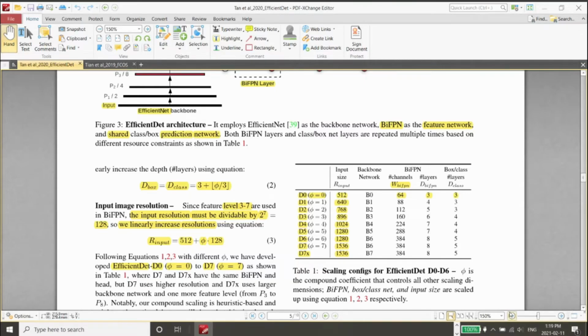Yeah, my recollection is we were getting the best results with the D3 backbone. I didn't realize there was a connection to the input size. That's because I'm actually doing, I think, 768 when getting that particular score.